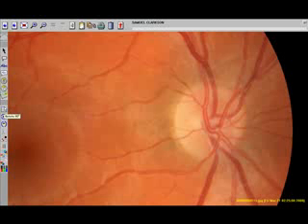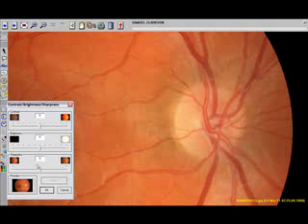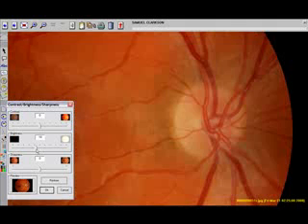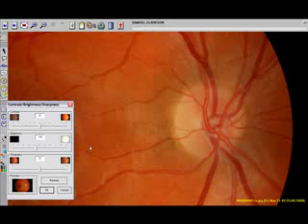The next three icons adjust orientation of the image. If you wish to reduce the brightness of the optic nerve, go to the brightness, contrast, and sharpening tool. Reduce brightness to the left a half a line at a time. If you wish to increase sharpness, move sharpness about halfway up the scale.